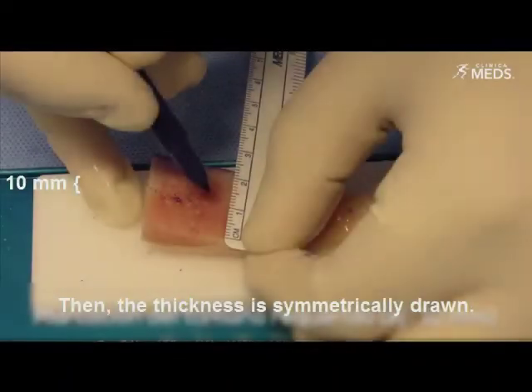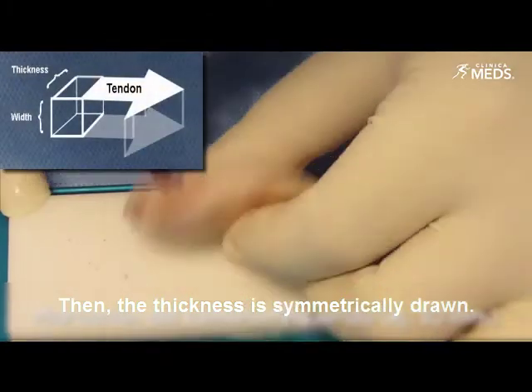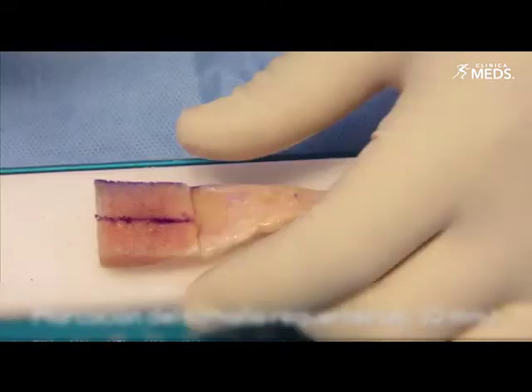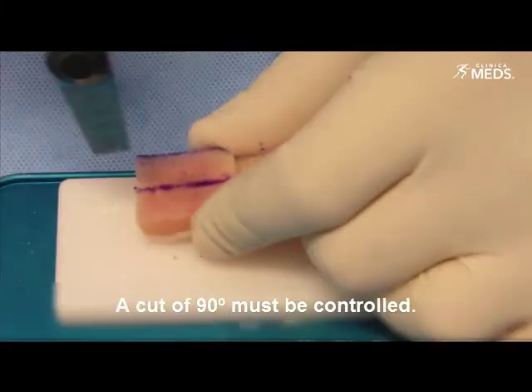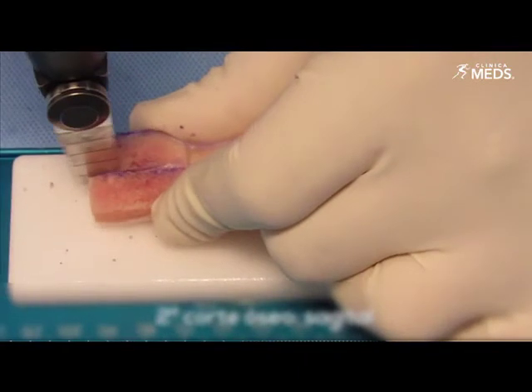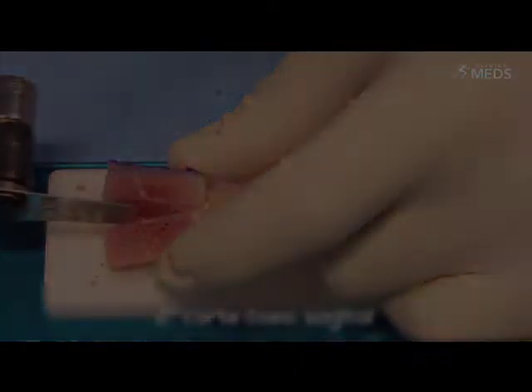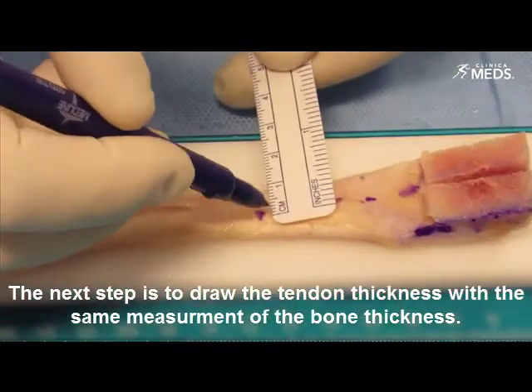Then the thickness is symmetrically drawn. A cut of 90 degrees must be controlled.